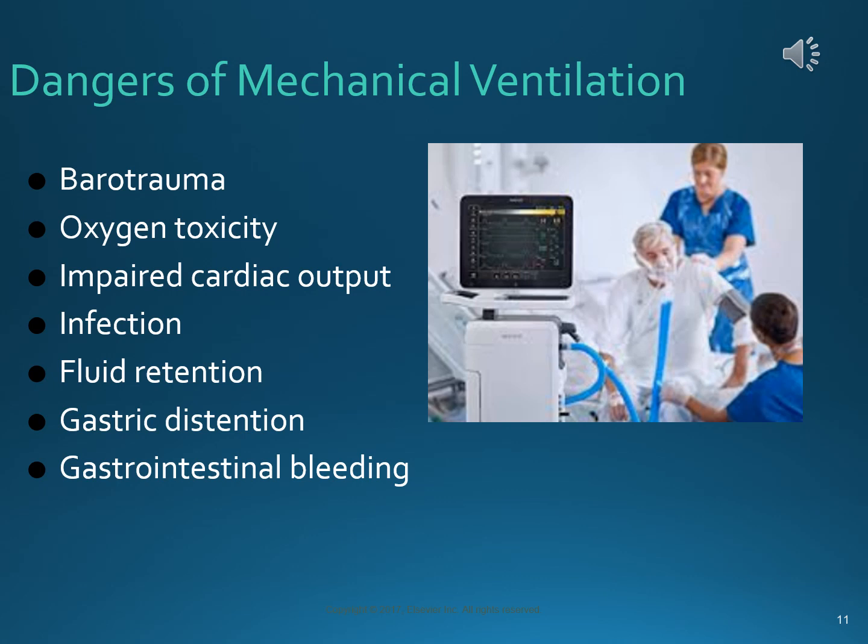Impaired cardiac output usually happens when you have extra pressure involved. So if you've got, let's say, a lot of PEEP, positive end expiratory pressure, the pressure in your pulmonary vasculature is higher than normal, causes your heart to work harder than normal, and can impair your cardiac output.